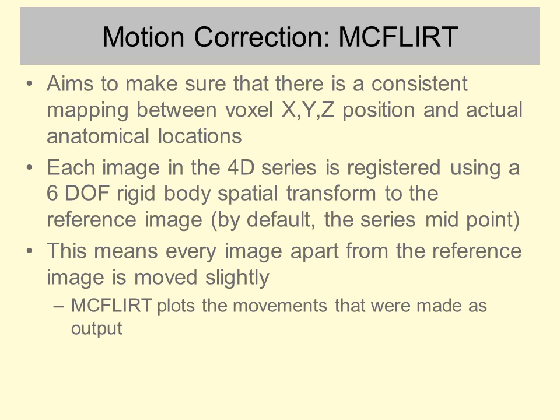But if you do choose this option, it's called PACE, P-A-C-E, in the Siemens scanner here at Reading, then you won't see much in terms of output from your post hoc motion correction with McFlirt. But that doesn't mean they didn't move. If you used PACE, you need to try and get into the Syngo, the operating system for the scanner, to get out those values that tell you how the acquired volume was moved around during scanning, so that you can actually get some idea how your participant moved, because PACE can give you the false impression that they didn't move.